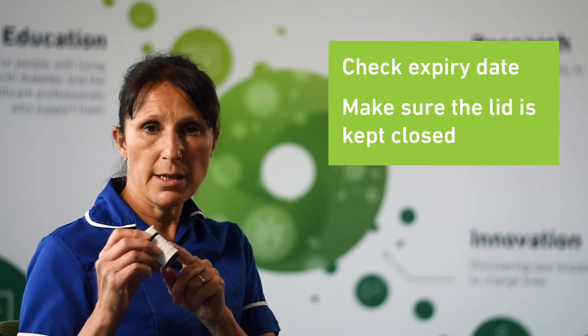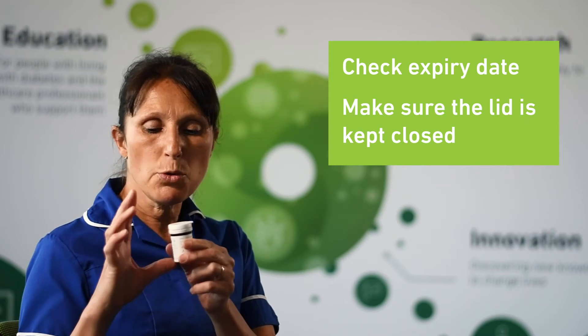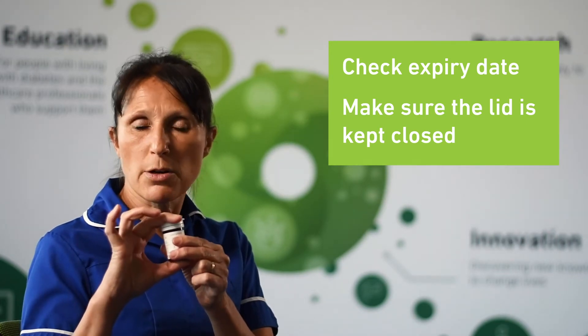The next thing you need to do is to take a strip. You must make sure that you have checked the expiry date on the pot of strips before you use them, and you must always make sure that the lid on the pot of strips is kept closed. Take a strip and put it into the meter — this will turn the meter on. You are now ready to take your blood sample.